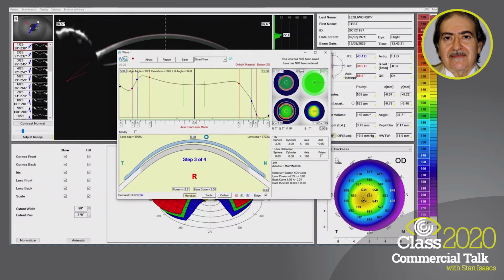Okay, because this cornea is not very, very distorted, we decided to do this on a geometric, symmetrical surface where we have two meridians along the flat meridian and along the steep meridian.